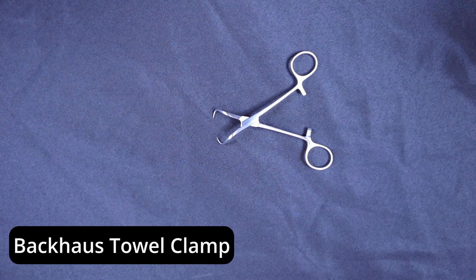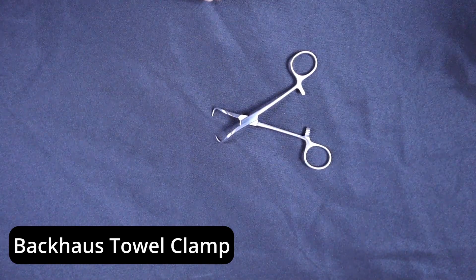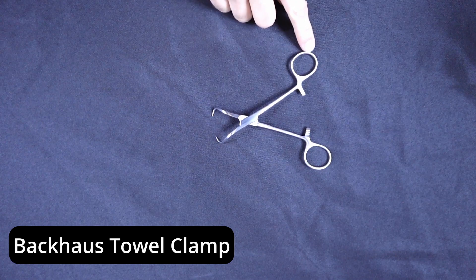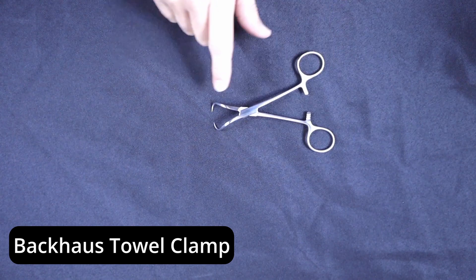Hello, my name is a Backhouse towel forcep. Today's instrument is also known as a towel clamp in many of your facilities. This particular model that we're looking at today is five and a quarter inches long. When measuring your towel clips, you're going to measure from the ring handle to the tip.